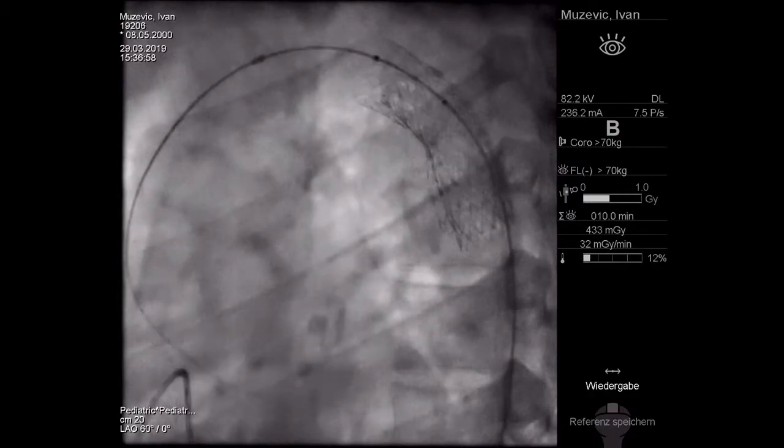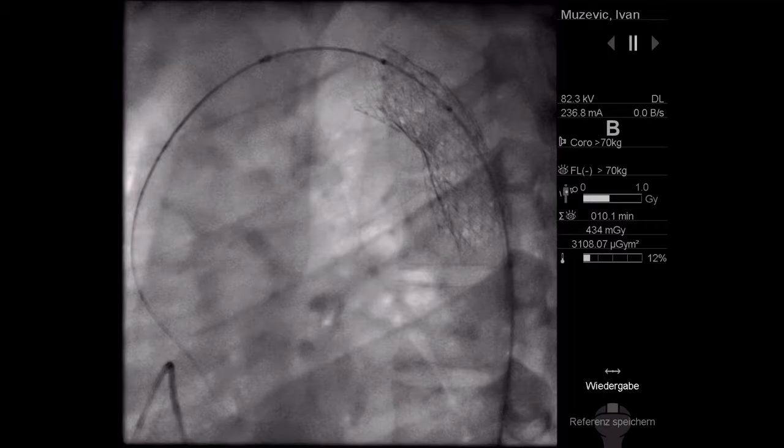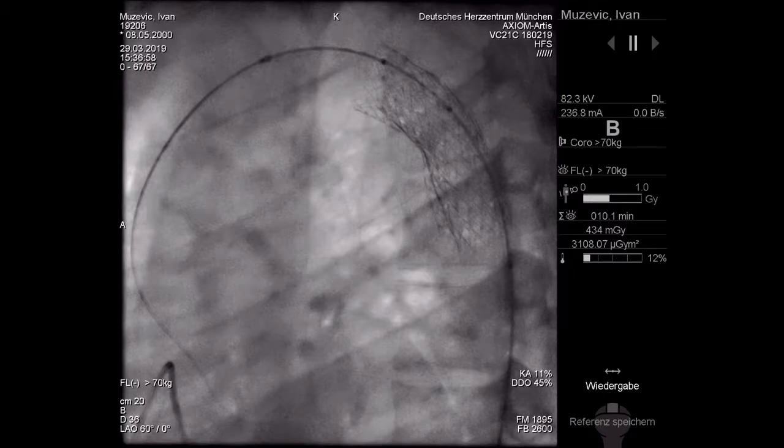So I start here, right? But I'm really careful because the transverse arch was not so large. I think I just want to mold it in with perhaps 4 or 5 atmospheres, not more. And then go a little bit down.